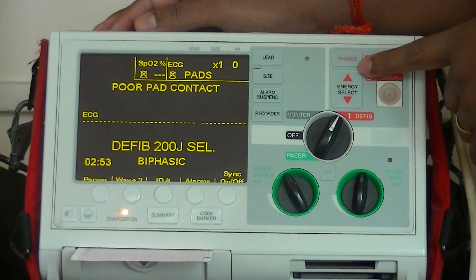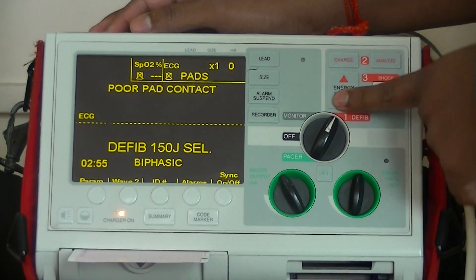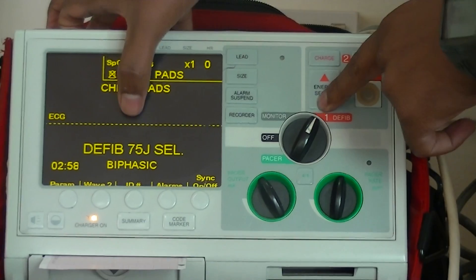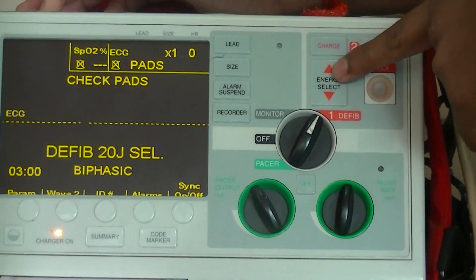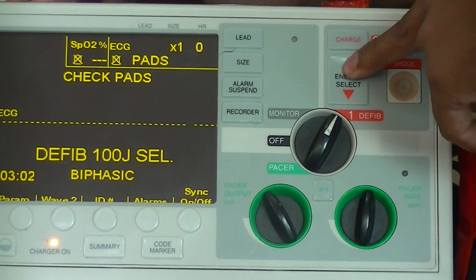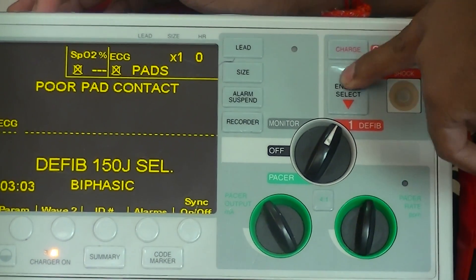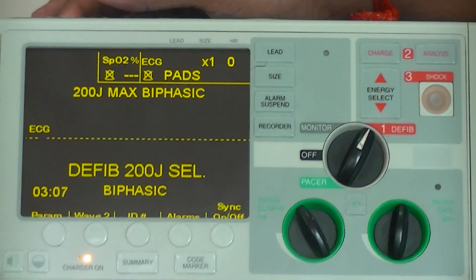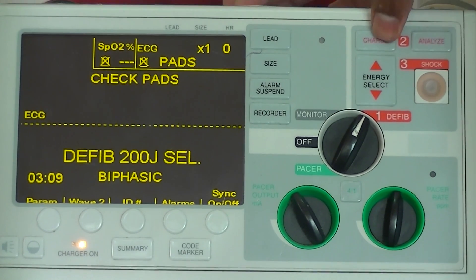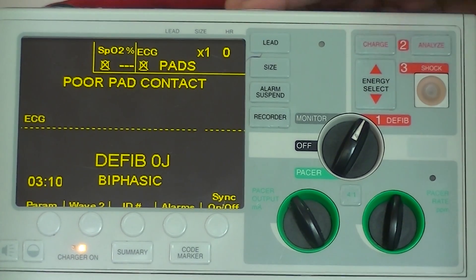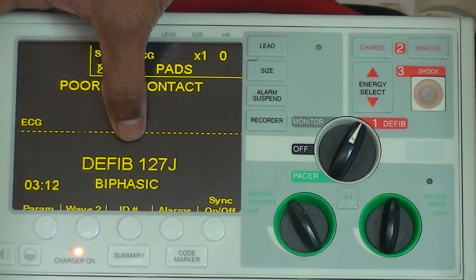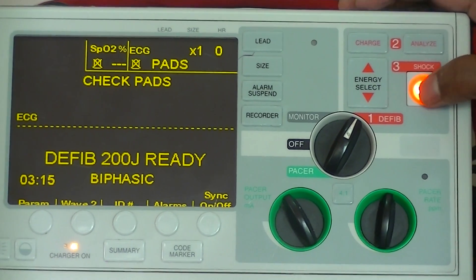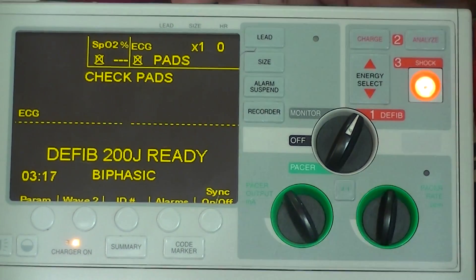When you want to select manual energies, you can increase or decrease — you can see the energy level is dropping, and to increase, the energy is increasing. Maximum, you can increase it to 200 joules. Then press charge, the energy will be charged to 200 joules, and once it is ready, you can press the shock button to deliver the shock.